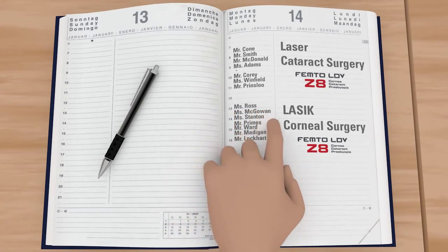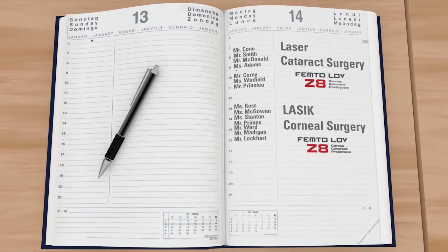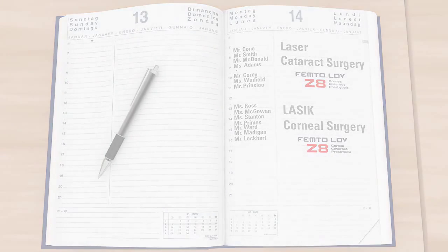For corneal surgery, the design of the Femto LDV's patient interface has proven to be efficient and extremely precise.